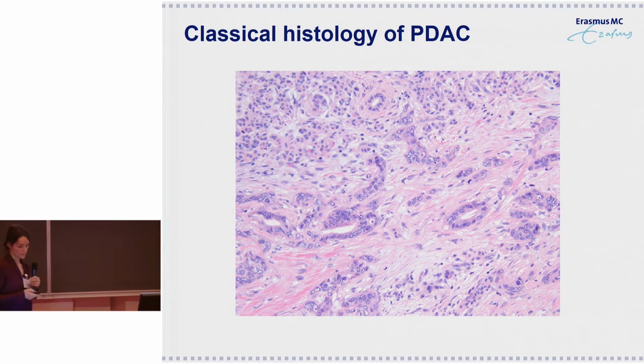And the other possibility is this kind of tumor, which is less well defined. The structures are irregular but small, and some parts of the tumor do not show any glandular structures at all, so no ductal differentiation. This is also typical of ductal adenocarcinoma, actually, to be heterogeneous within a lesion. So you can see in the histology different kinds of differentiation. Why am I showing this?